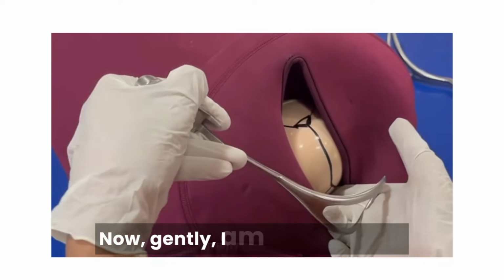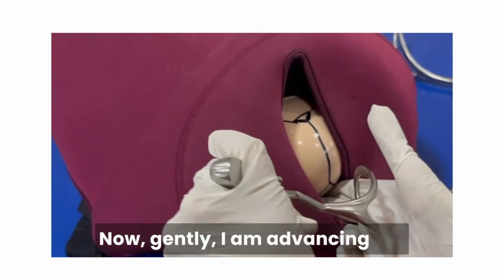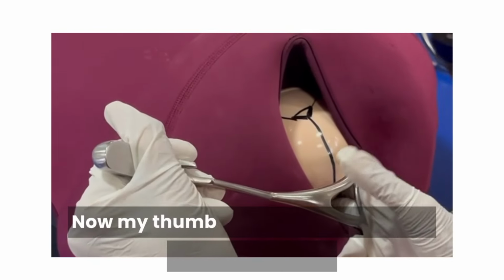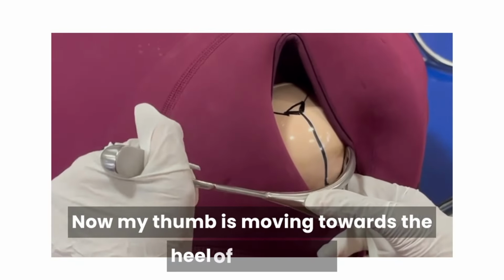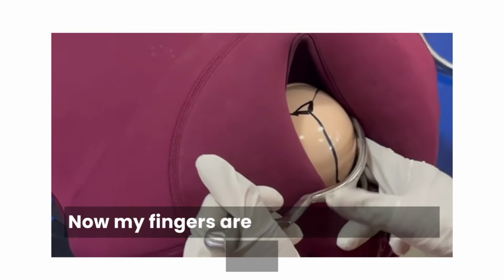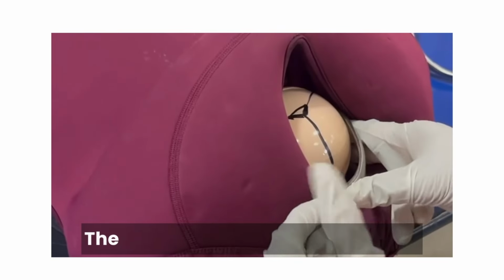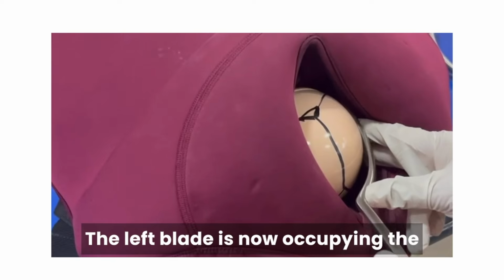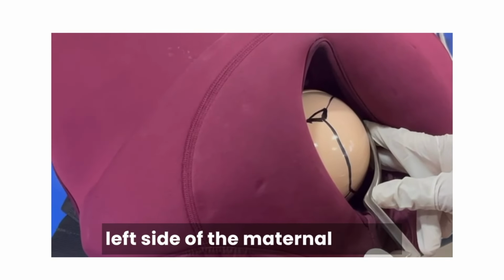Now gently I am advancing the blade into the maternal pelvis. Now my thumb is moving towards the heel of the blade. Now my fingers are guiding it in such a way that the left blade is now occupying the left side of the maternal pelvis.